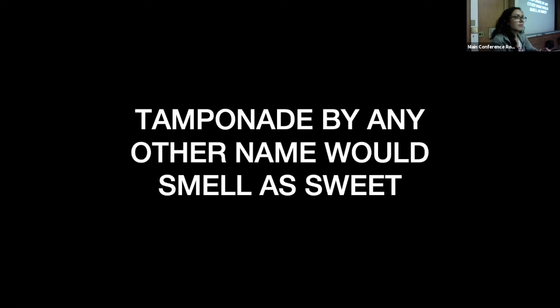I mean, the truth is that most tamponade you identify are not in need of pericardiocentesis. You're going to get a window because it's much better. I've seen way too many pericardiocentesis fail. Windows are definitive management. That's the ideal. But obviously, sometimes you're not going to have a choice, so you should know how to do a pericardiocentesis. Most of the patients you're probably going to identify in your career with tamponade are going to be stable enough to get the window.